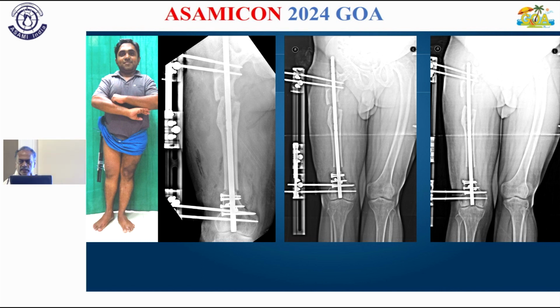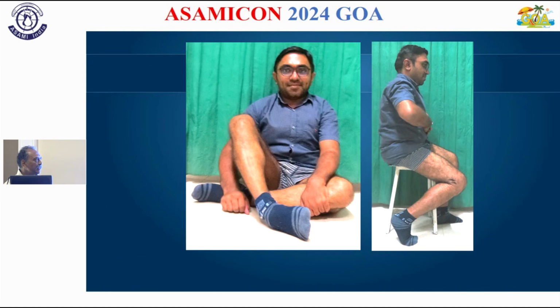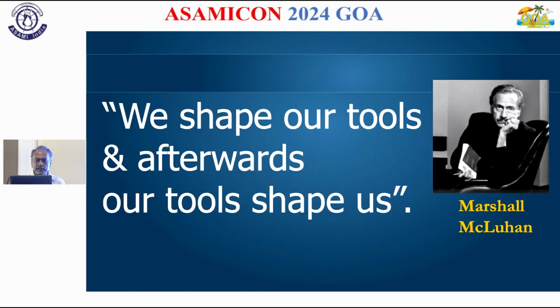Two osteotomies, acute correction of the valgus at the lower level, varus at the upper level. We allowed whichever osteotomy wanted to lengthen to that extent. And then at the end, we locked him in both the places. The bone consolidated well to give him an excellent correction of his length as well as all the deformities.